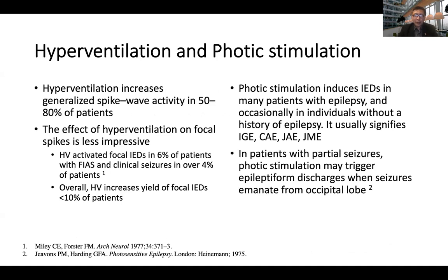Hyperventilation and photic stimulation might be useful, increasing the generalized spike wave in about 50 to 80% of patients. But for focal epilepsy, like detecting the focal spike, it is less impressive. Hyperventilation activates focal IED in only 6% of cases with focal impaired awareness seizure, and clinical seizure in over 4% of cases. Overall, hyperventilation increases the yield of focal IED in less than 10% of patients.